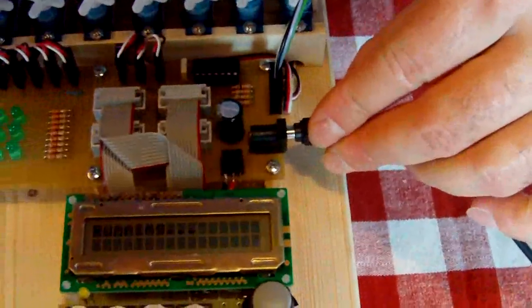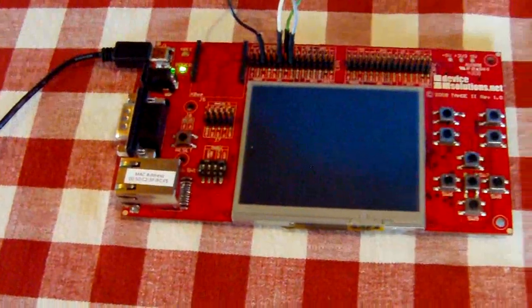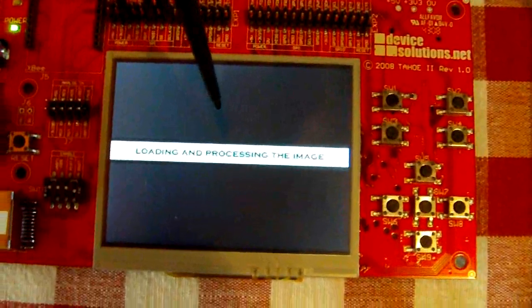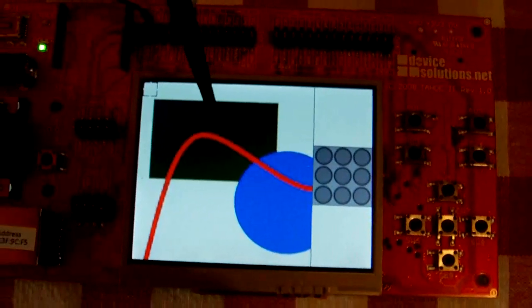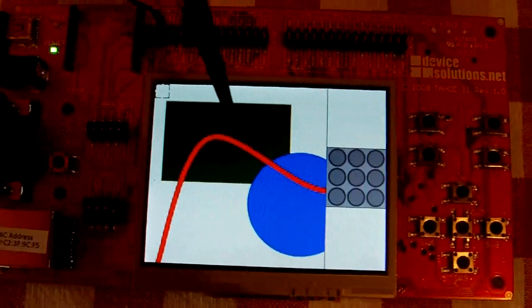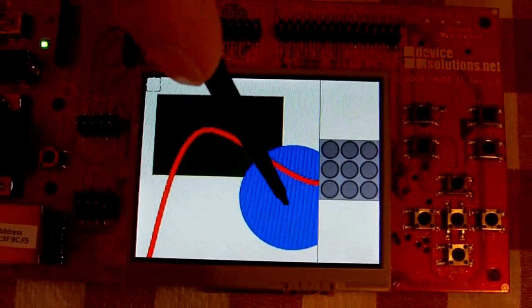Let's see the device working. I power on the boards — first the secondary board, and after the main board. This is the program splash screen. Now the first image is being loaded and processed. Just a note: the demo images in the prototype are loaded from the program resource bundle, but the aim is to give the possibility to use an SD card formatted with FAT32 file system to load them from. The image is loaded.